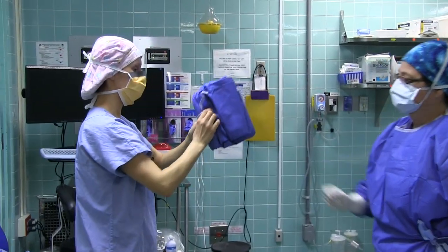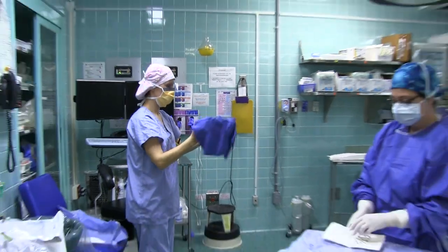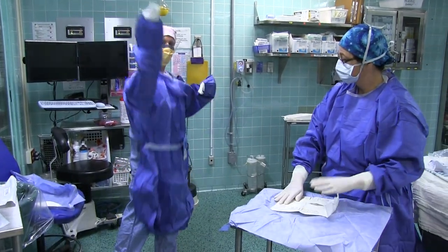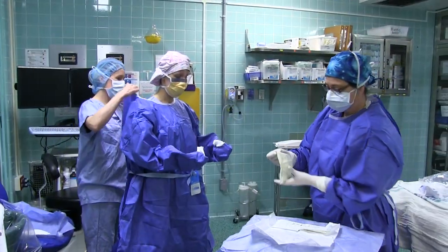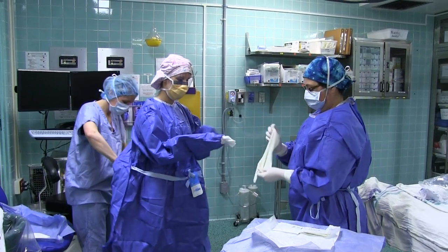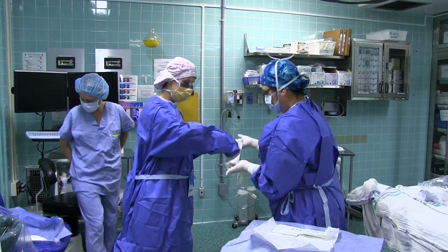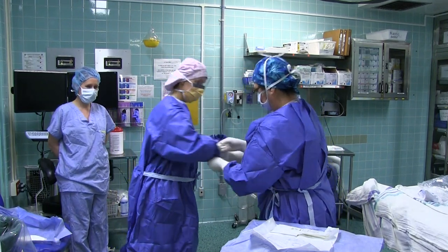The scrub nurse will then hand you a sterile gown to put on. The circulating nurse will tie your gown and the scrub nurse will glove you. Note: the sterile gloves must cover the white cuff of your gown.